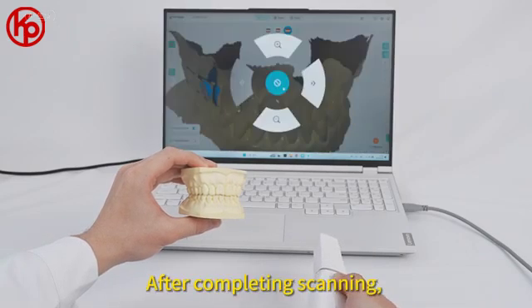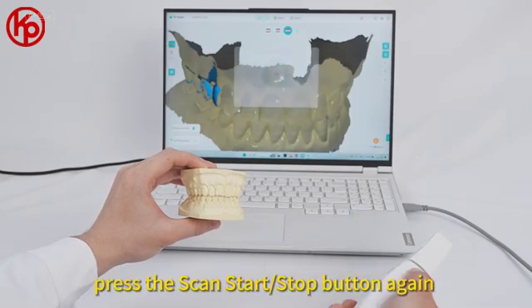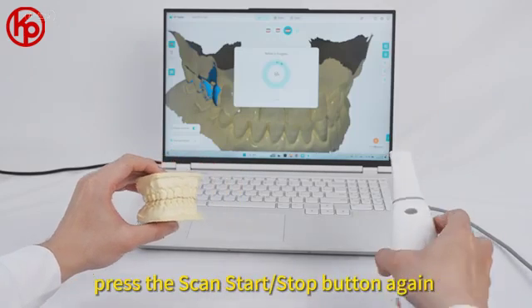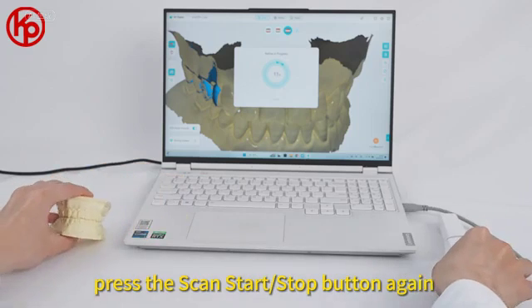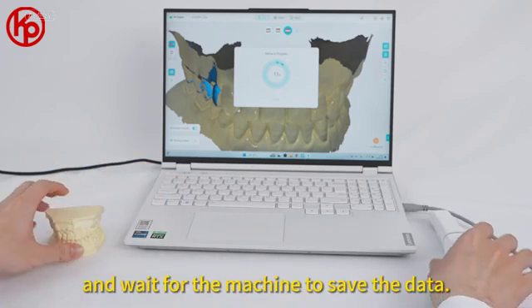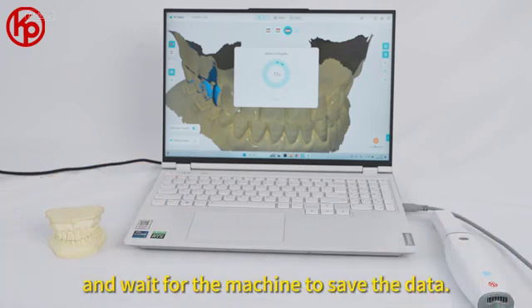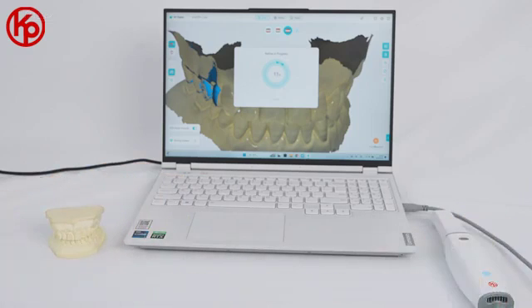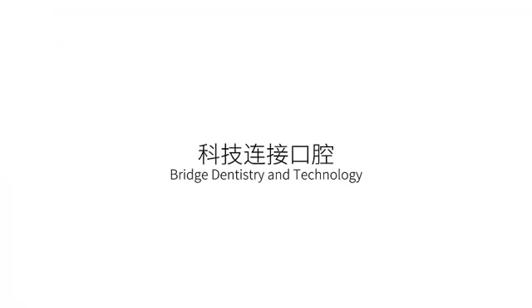After completing scanning, press the scan start or stop button again and wait for the machine to save the data. Step 2.